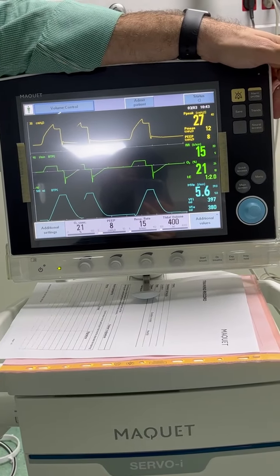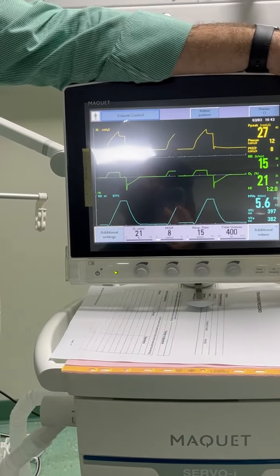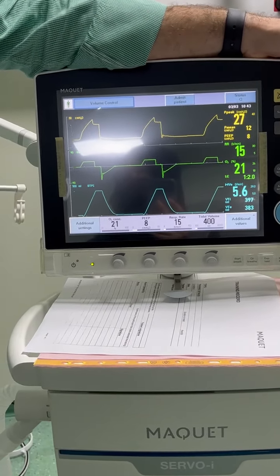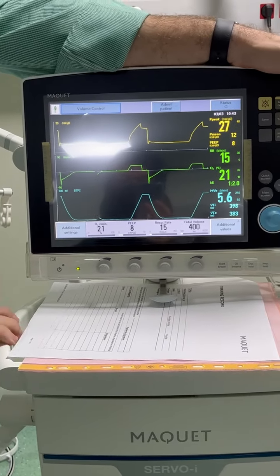These machines were requested due to COVID. But at that time, the peak of COVID, the aim of the government was to bring ventilators, high quality ventilators, without extra options. That's why they bought this one.